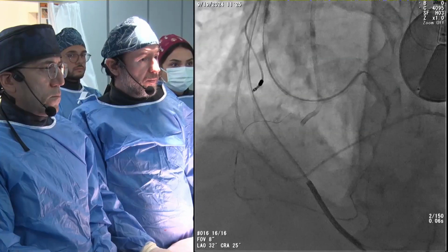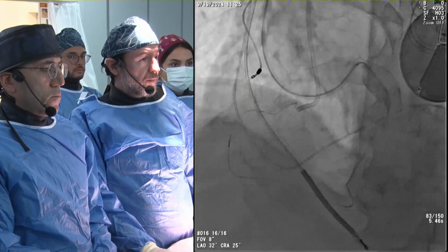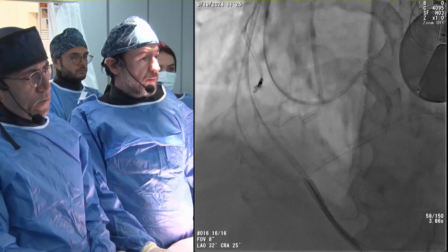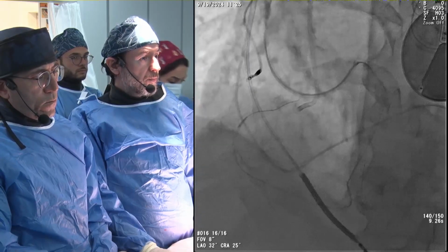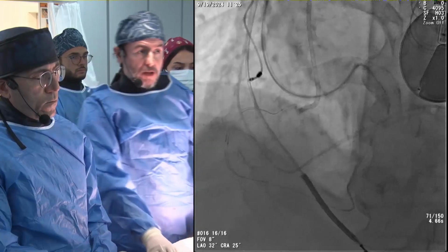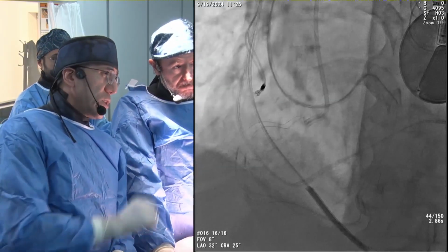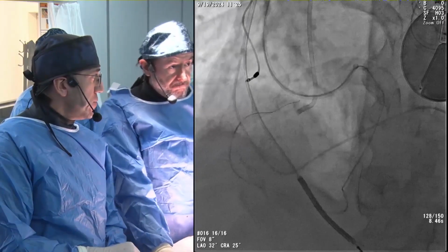And I don't know if you think that there is a capacity to advance a double-lumen microcatheter to do some kind of parallel wire behind it or not. And we should think about these concepts. And may I ask panelists if you have any comment about this case? Dr. Tarek or other panelists? Şevket abi kolay gelsin. At this moment, try to carry the retro microcatheter as far as we can to the proximal part, and some Carlino could help us.